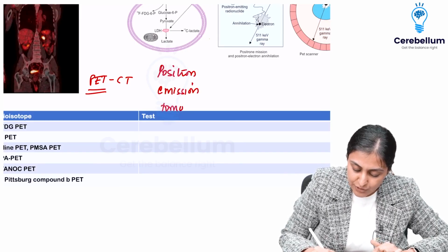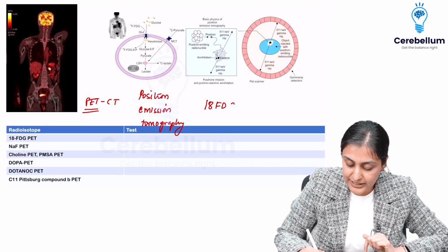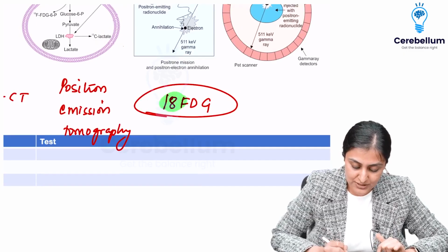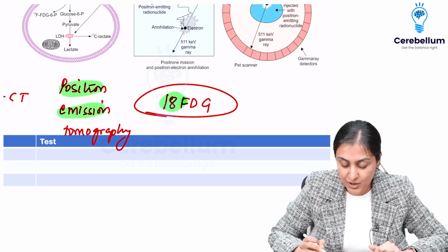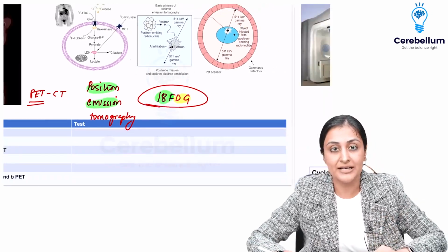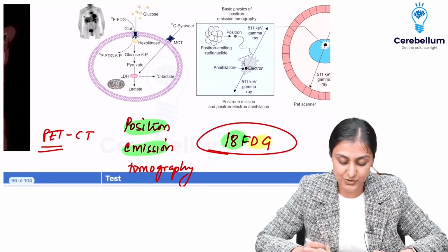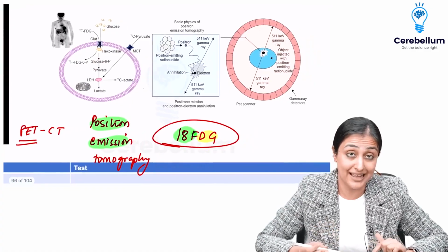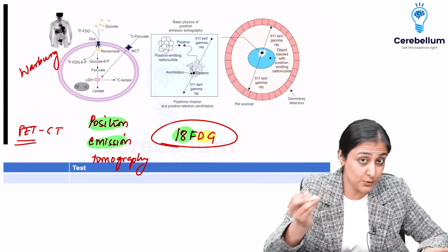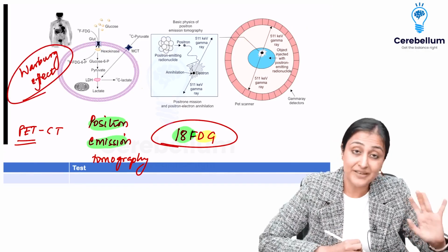Positron emission tomography. So this is where I use a compound that is 18-fluorodeoxyglucose. 18-fluoride is what is used as a positron emitter. Deoxyglucose is the carrier. So you know how the cancer cells in the body are all relying on glucose preferentially, right? So these are the cancer cells here which are preferentially utilizing glucose by glycolysis, which is anaerobic glycolysis. That is a bit controversial whether it's anaerobic or aerobic. Decide whatever you want to. So this is the Warburg effect, right?